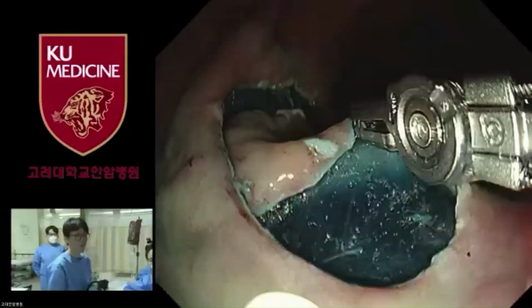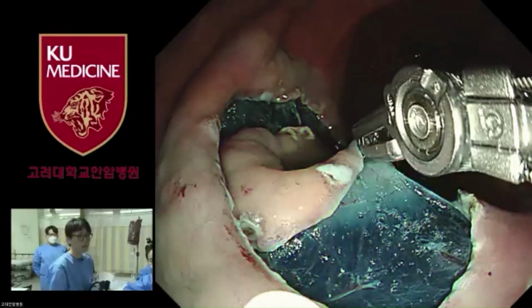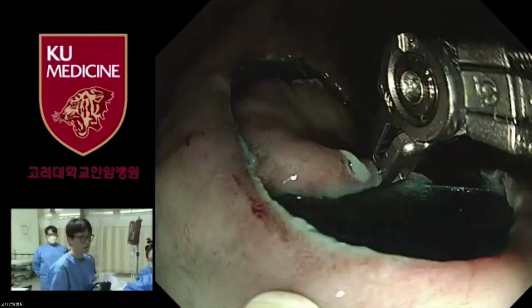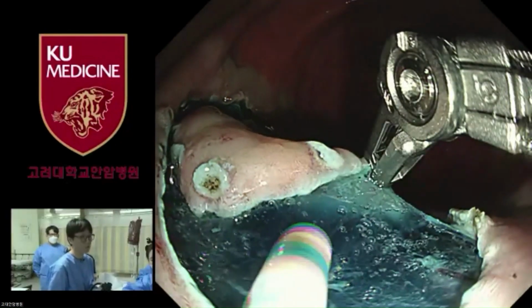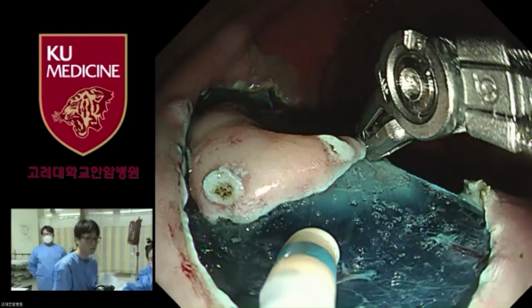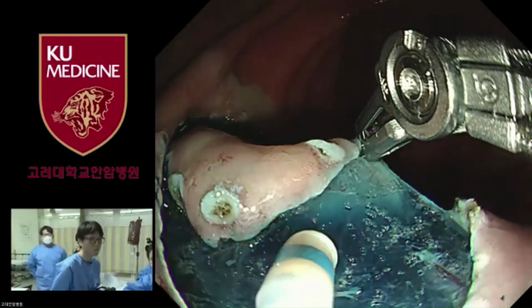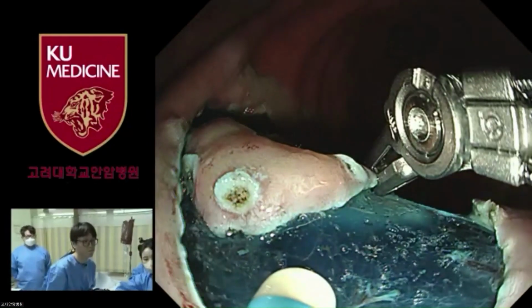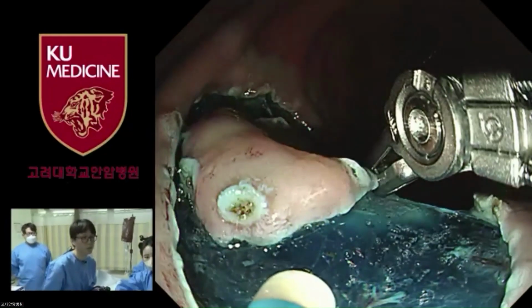Already the submucosal solution has decreased, so is it better to inject more? Yes, maybe more injection is needed, but I think since we are using this robotic device, we can just pull up and make the submucosal space a little wider, and then we can make the dissection plane appropriately.